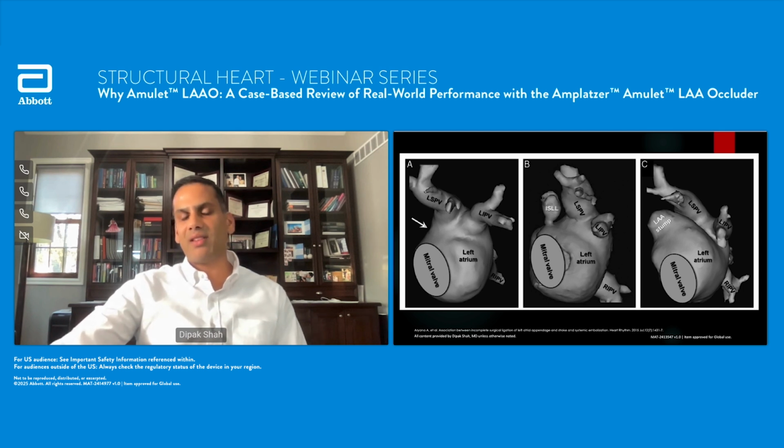And I definitely think that the Amulet with its dual mechanism is really the go-to closure for this kind of issue, as it is for any proximal appendage issue. Because what you're gonna have to do here is get the lobe past the neck, and then you'll just put the disc out in this area, and you're gonna have this kind of drywall or flush repair. If you stick with a Watchman, you're either gonna have to deep seat the Watchman inside, you're gonna leave the neck behind, or it's gonna kind of give you this big kind of shoulder out into the left atrium, which I just don't think is ideal for these patients.